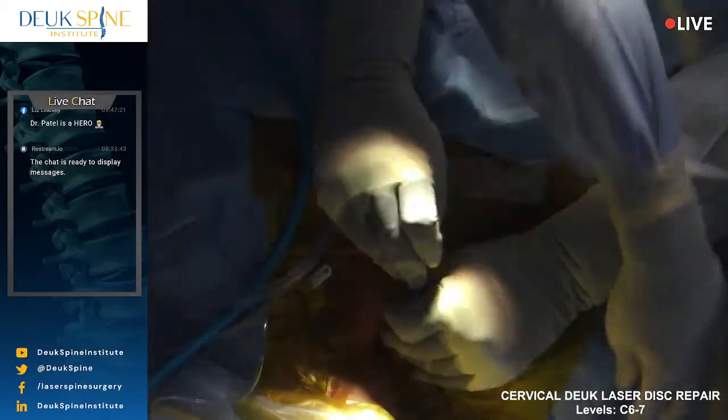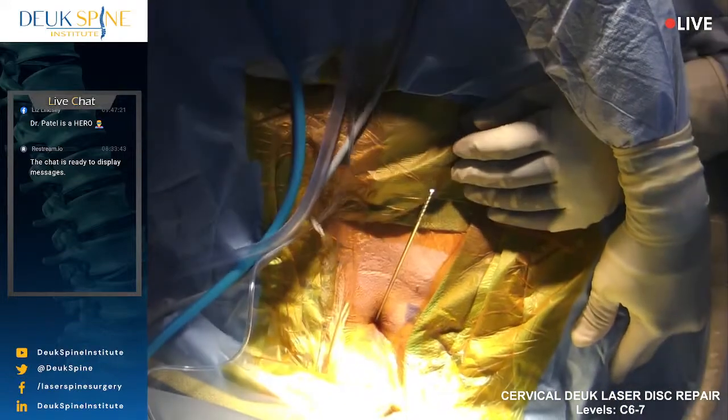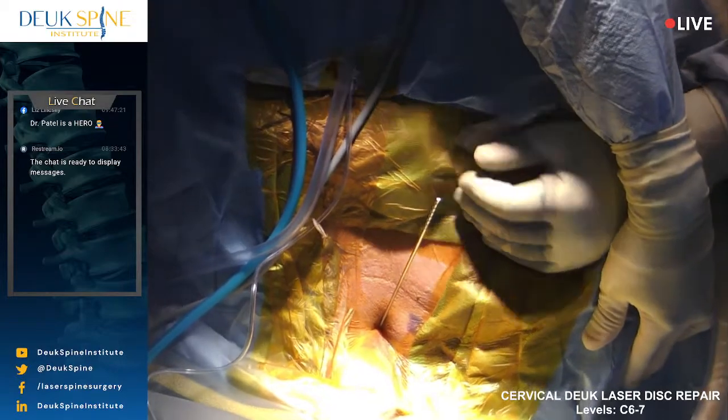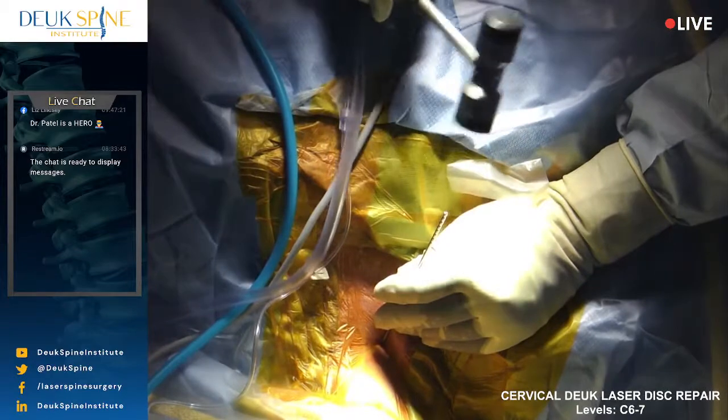And I'm going to try to, no, just hold on, let me see. Yeah, you know, we're not going to get the discogram done. Okay. Let's just move forward. Okay. That looks really good. We're at the back of the disc with the dilator. I'm just going to go another millimeter.